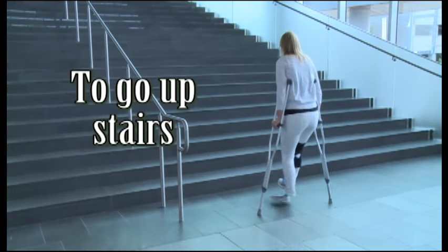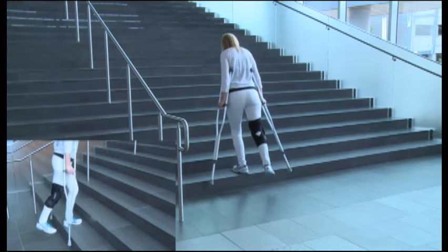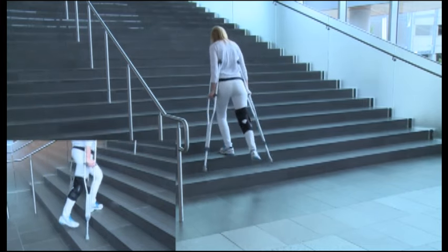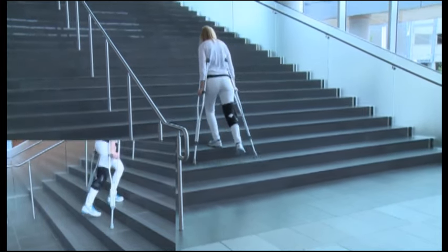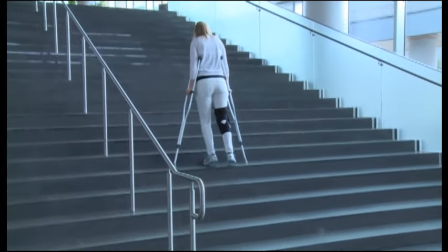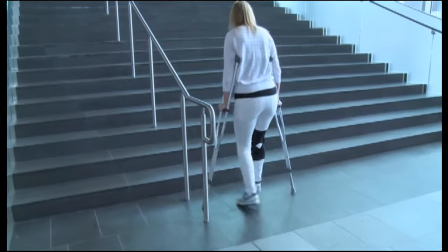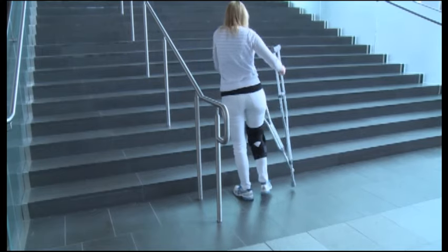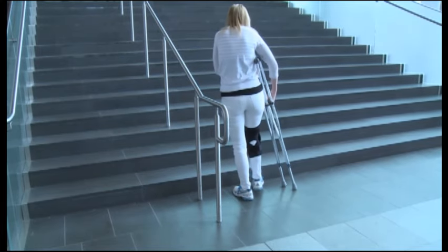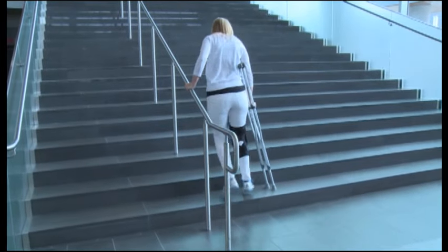To go upstairs non-weight bearing with crutches, begin close to the bottom step. Push down on the hand grips as you step up with your healthy leg, then bring the crutches up next. Check your balance before you continue to the next step. If there is a sturdy handrail available, place both crutches under one arm, hold the rail with the opposite arm, step up with the healthy leg first, and the crutches follow.